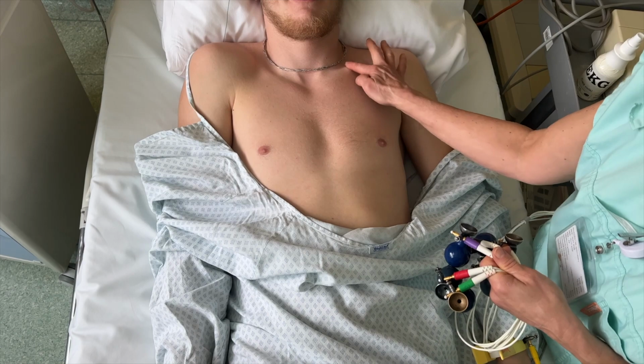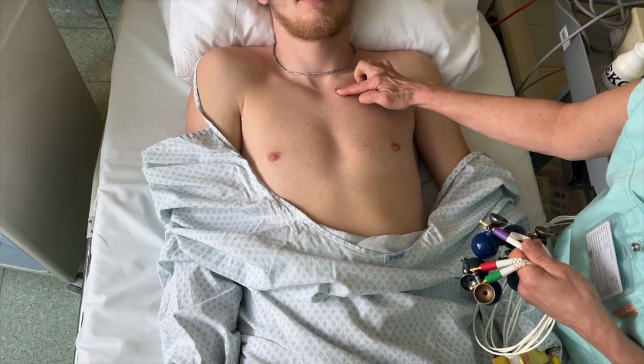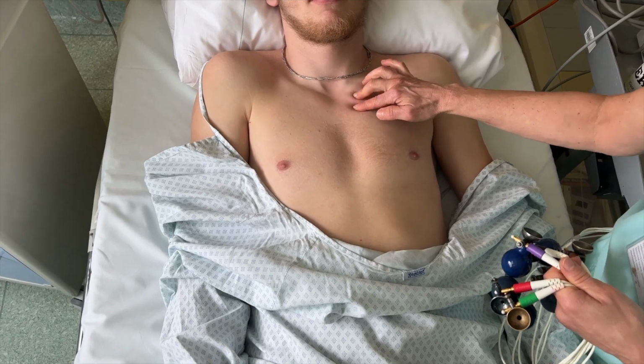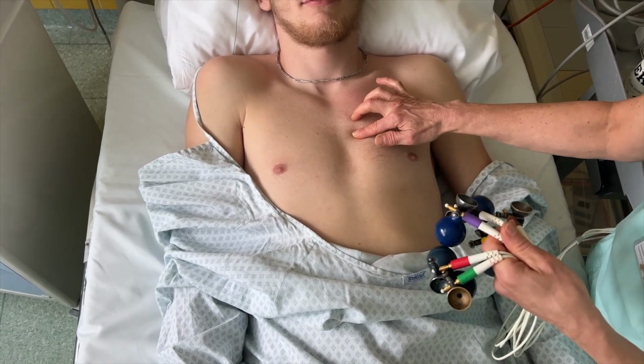We will do this practically as follows. First, we palpate the first intercostal space below the clavicle. Then the fingers move along the edge of the sternum until we count the fourth intercostal space.